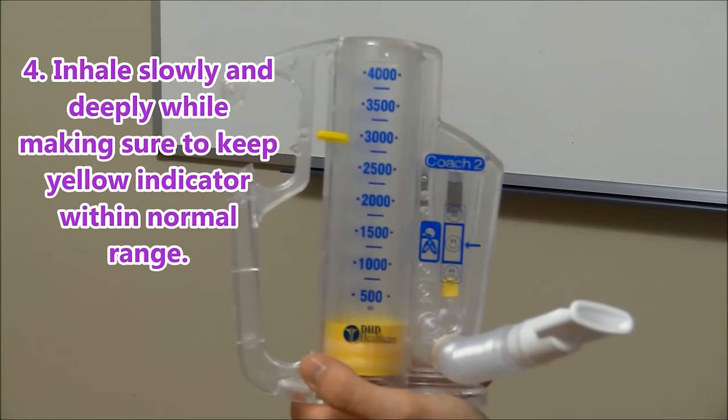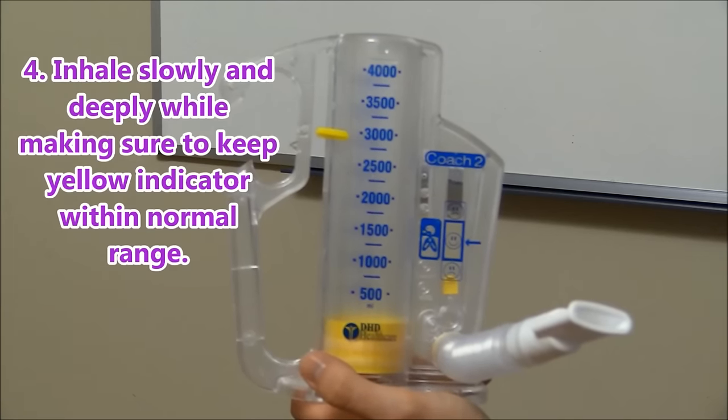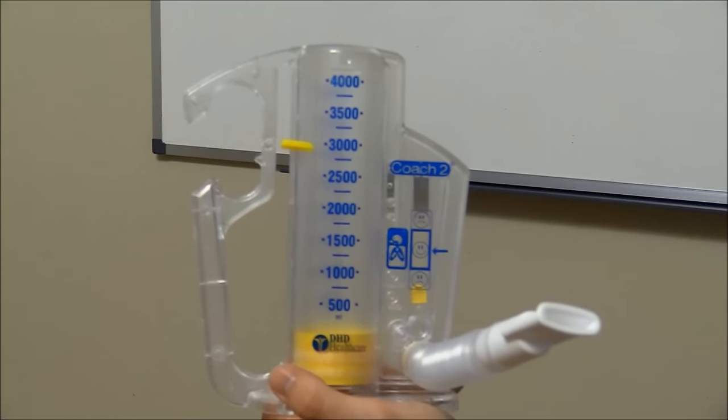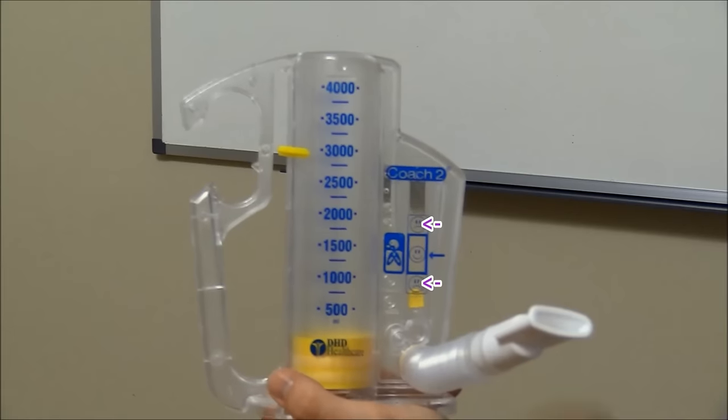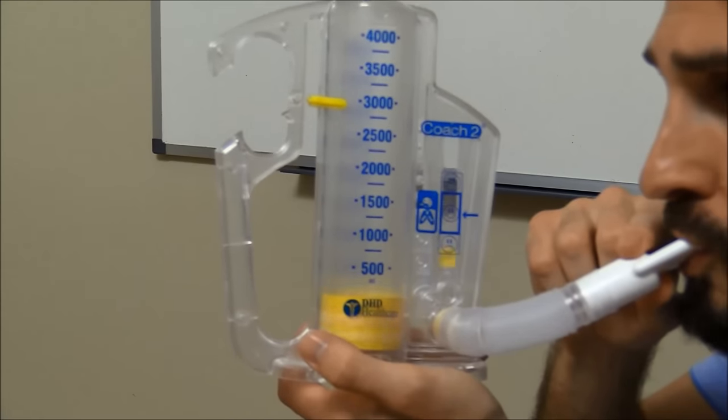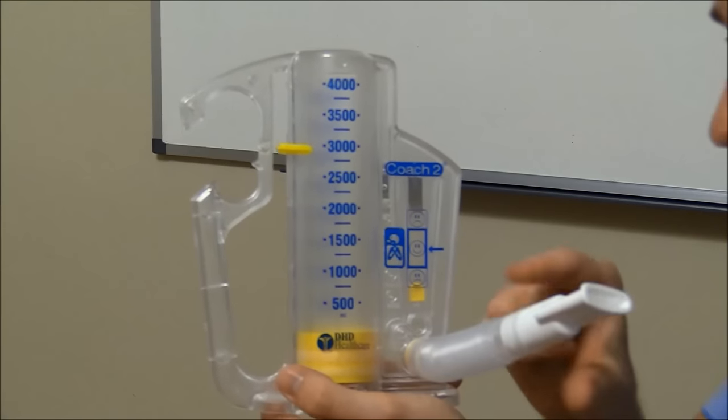Make sure to keep the yellow indicator on the side within normal range. They don't want that little yellow piece to go too high or too low. And as they do this, the piston will rise up.